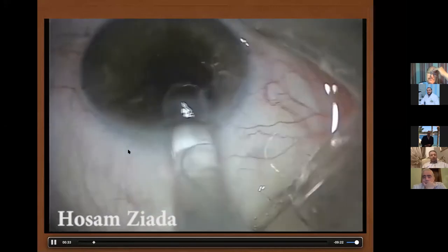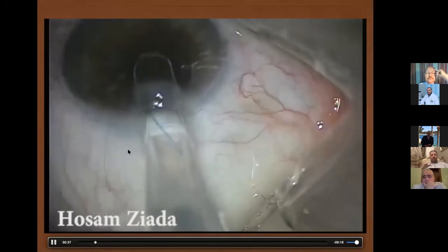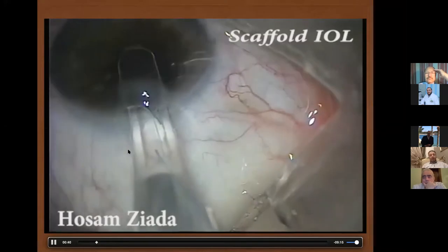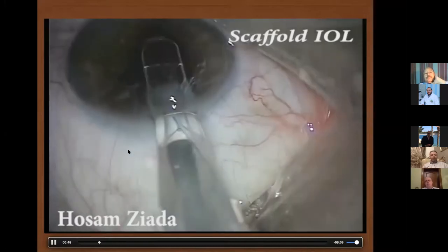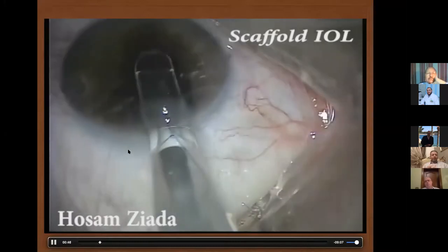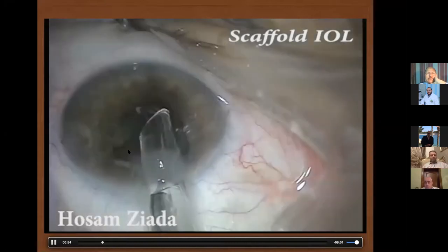we may put the IOL, which is preferably a three-piece IOL, in the sulcus after getting the fragments or part of the nucleus up in the anterior chamber and putting them on a side, supported by the iris and protected and surrounded by a sufficient amount of viscoelastic.